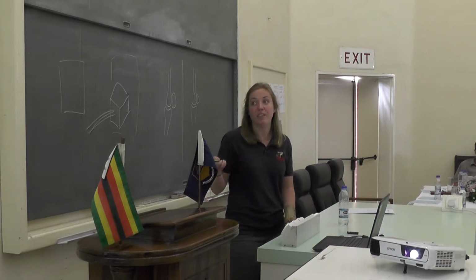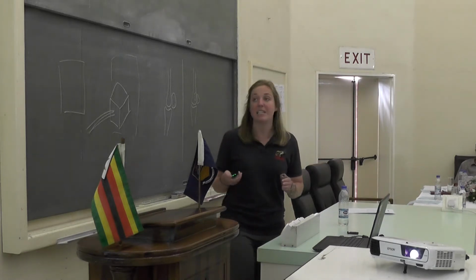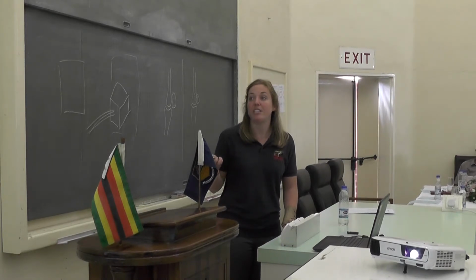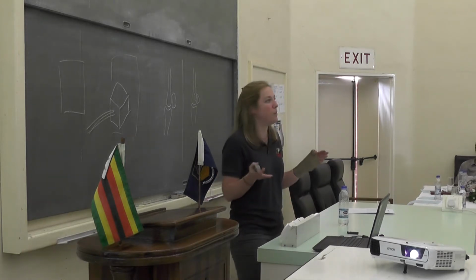In this case, you'd have the cassette on the floor, and you would have your camera doing this view instead. For this, you need a block like this, which is called a tunnel block, which essentially is a wooden case in which you stick the cassette, and that protects it from being trodden on by the animal, and then you obtain the same view. But essentially, you're still cutting the foot at the same 45 or 60 degree angle. It's the exact same thing, and this is what I mean about creativity. If you don't have an upright pedal block, don't panic. You just understand what the view is, how you need to obtain it, and you can figure out another way of doing it.